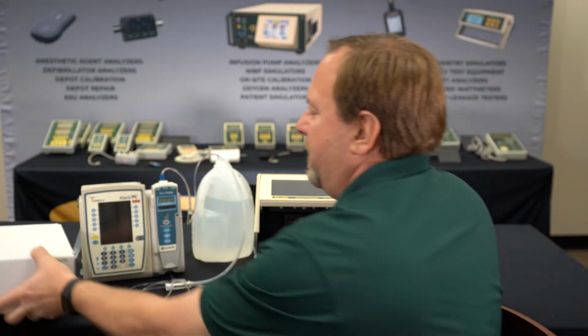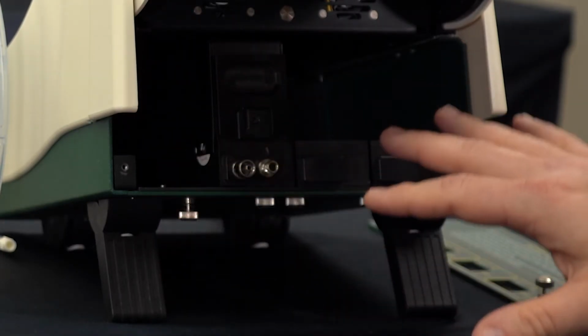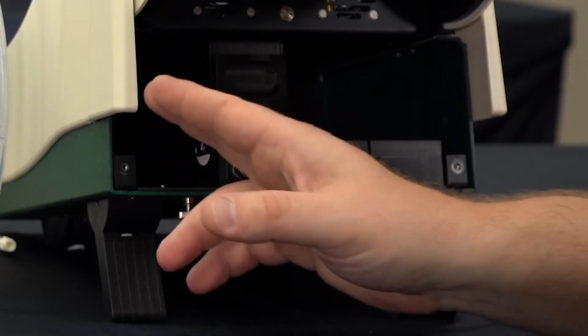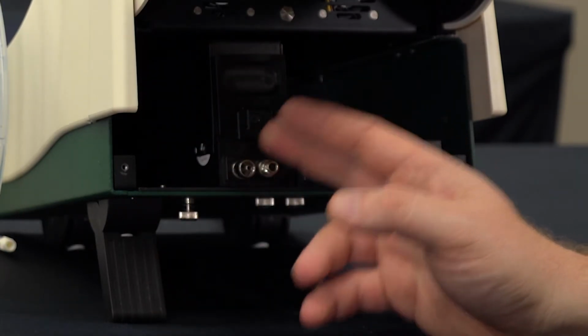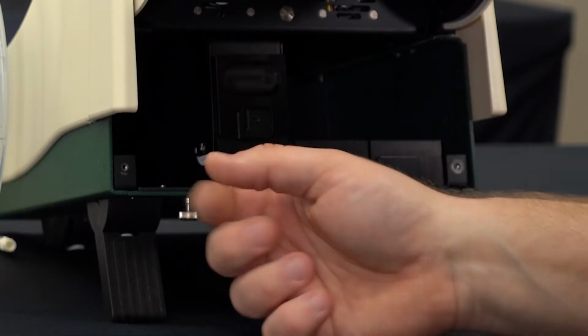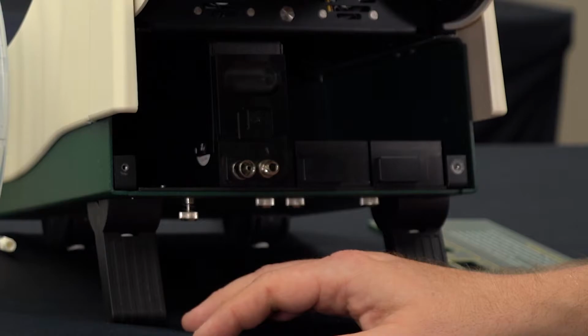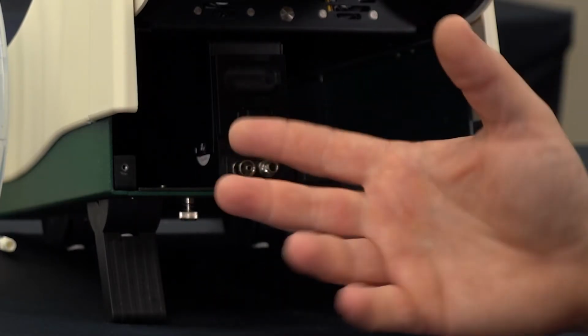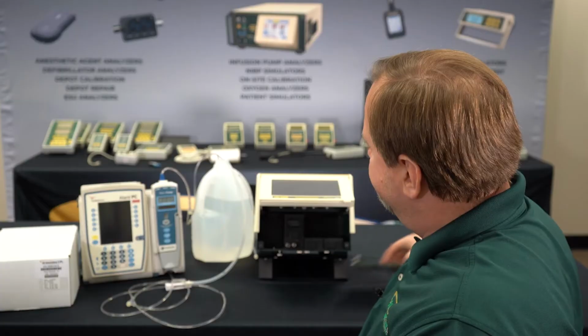The important thing to realize is that we only have to calibrate or send in 1 channel at a time as it's due for calibration. I don't have to send them all in, so we can start with 1 module and then expand to another one in another 6 months or so forth. That way we don't have to recalibrate all of them at the same time. I can stagger calibrations and continue calibrating throughout the year as I need to.